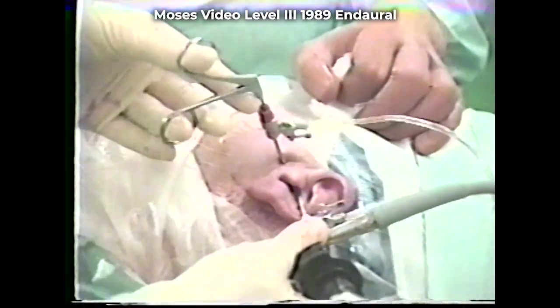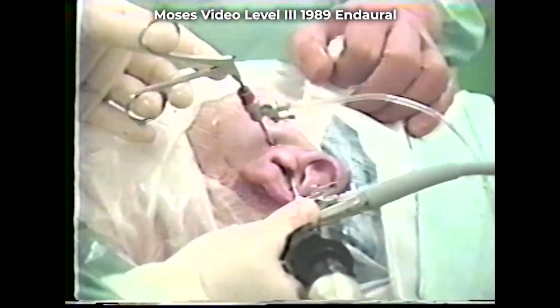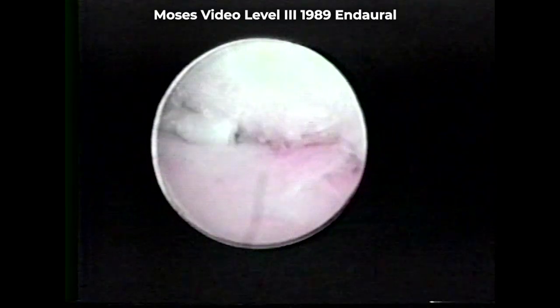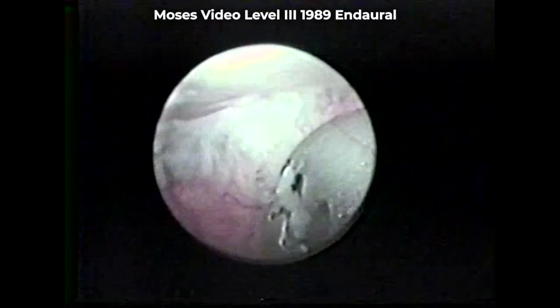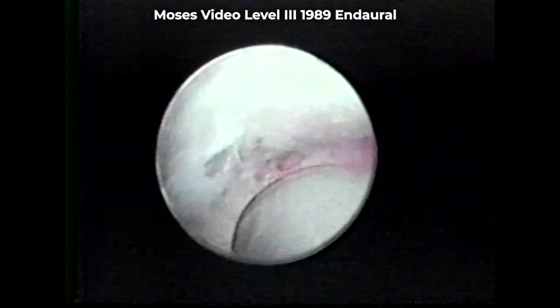The infralateral cannula can now be used to insert instruments into the joint. Here we can see a small cartilaginous fragment being pressed between the articular surface of the eminence and disc. A grasper forceps is utilized to retrieve the small fragment from the articular surfaces.